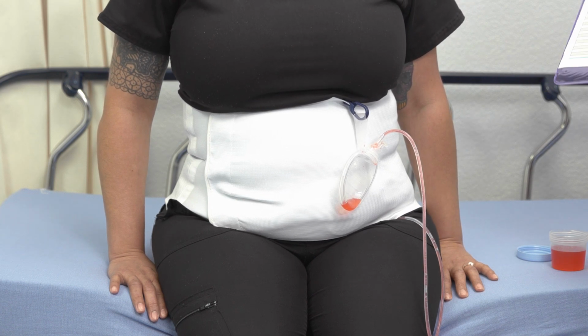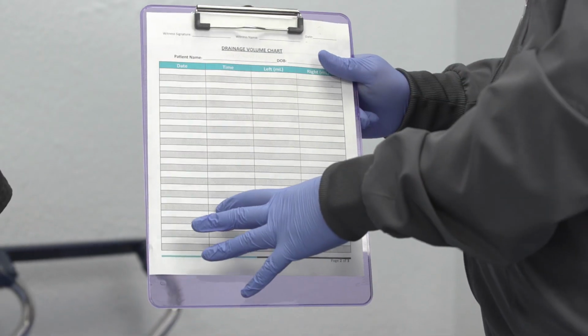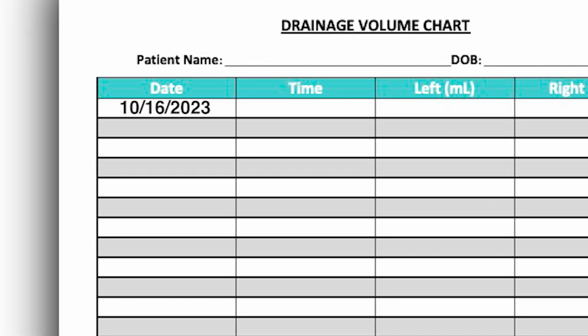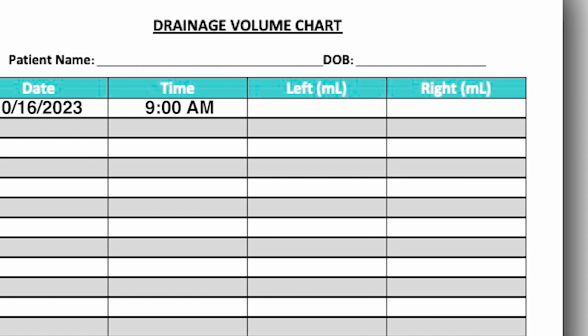So you will again refer back to the drainage volume chart form, which has 4 columns: date, time, left, and right. You will fill out the date that you were performing the task and the time that you were performing the task. Try to be consistent, because you want to drain this at least twice a day, just milking, but you want to try to do it at the same time every day. Then, whether it's the left drain or the right drain will determine where you put the amounts. And again, you want those amounts to be in milliliters.